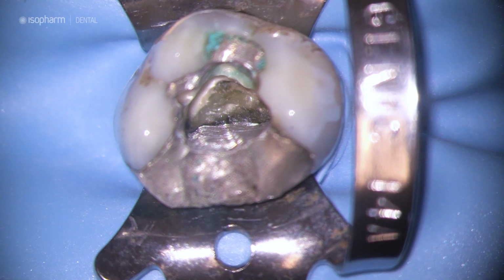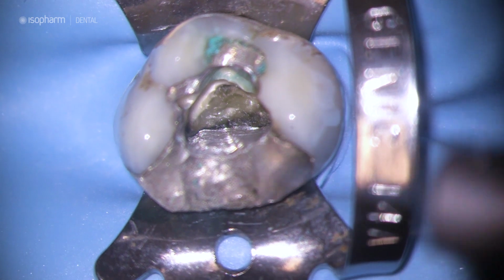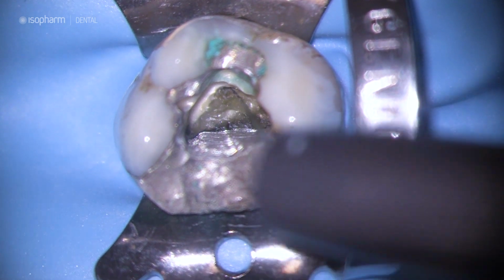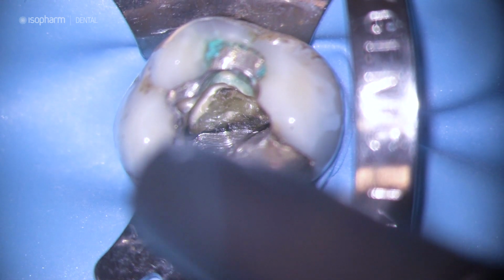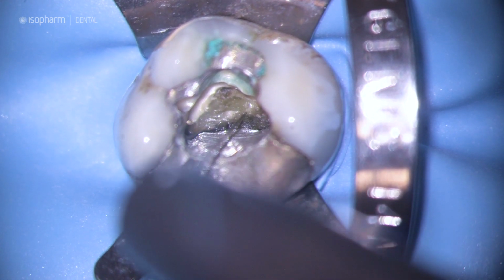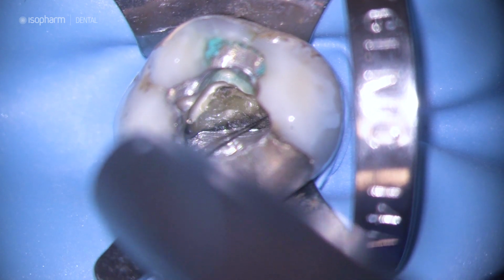And now all of a sudden, as you can see from the video, rather than seeing just the top of the file or your fingers in the way, the increased access you get means that you can now start to see the root canals, you can start to see the root canal orifices, and you can identify them much more simply. It's also really nice for opening up that coronal part of the canal.